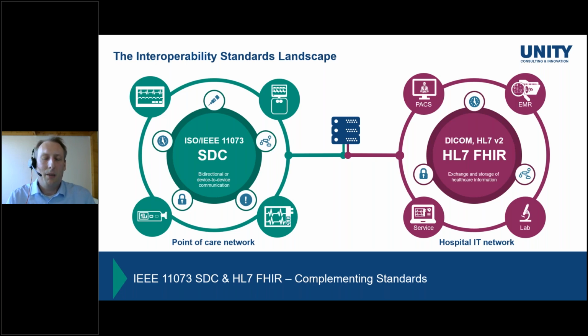On the right-hand side, we have the very established hospital IT ecosystem. And as you just pointed out in your vote, a lot of you or your institutions provide or use products that use established standards like HL7 version 2, maybe nowadays also HL7 FHIR. Here, from my perspective, the focus is more on analyzing long time series of data, managing and documenting the care of a patient, and being a little bit further away from the direct care of the immediate patient.